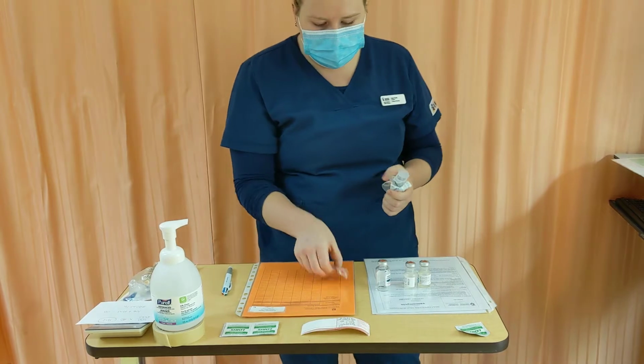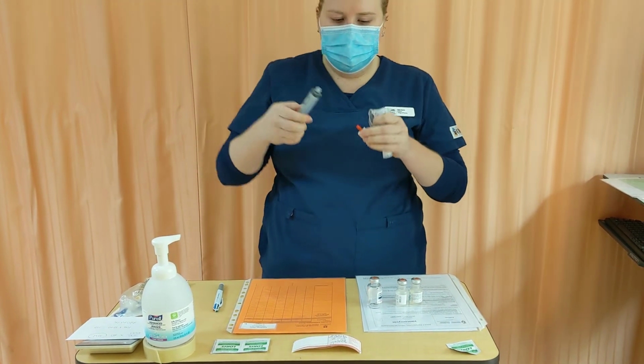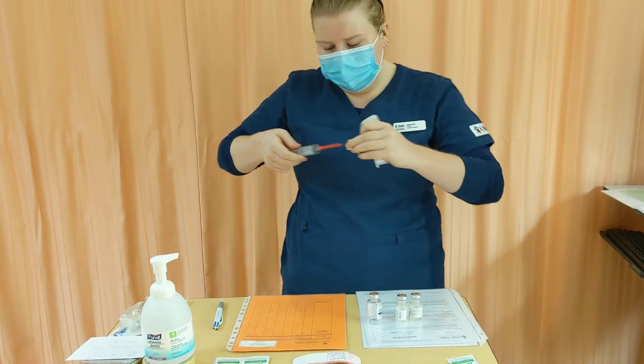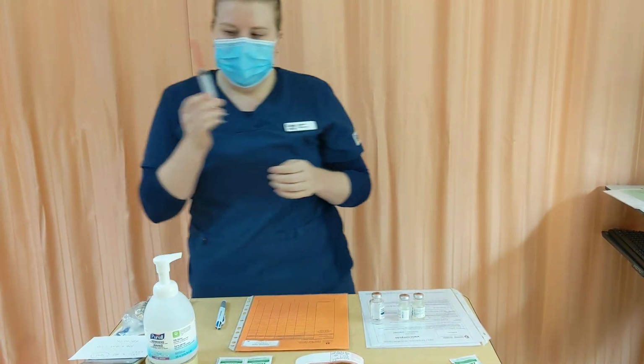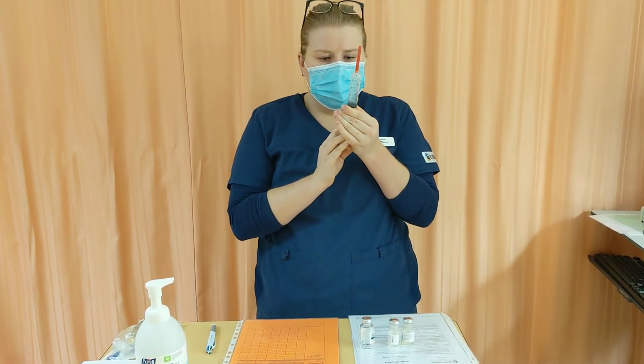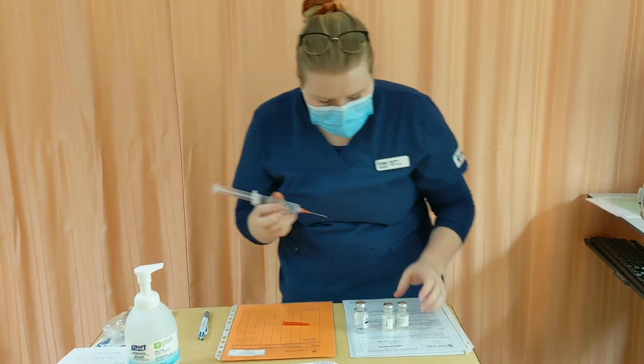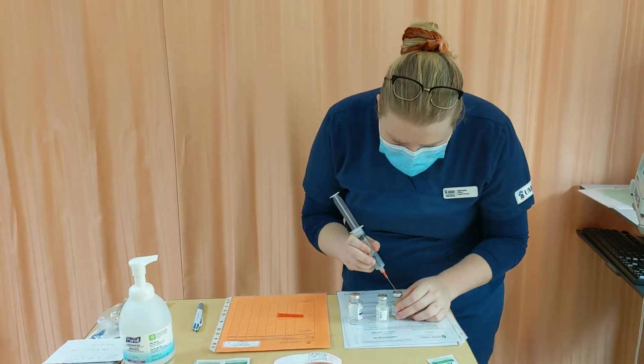While I'm letting them dry, I'm going to open my contents here. This can go in the garbage. I'm going to be drawing back the full 20 ml that I'm going to be inserting into here with the air to make the pressure system. Like I said, I've already cleaned these.